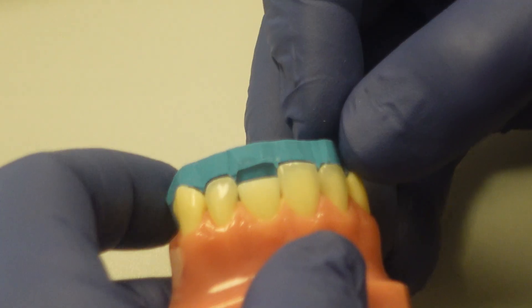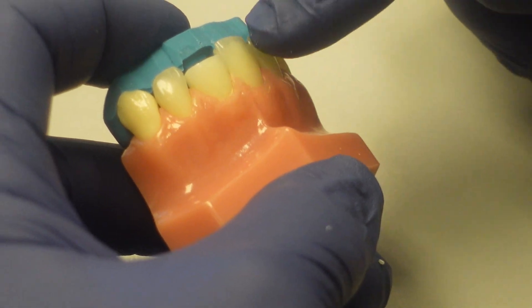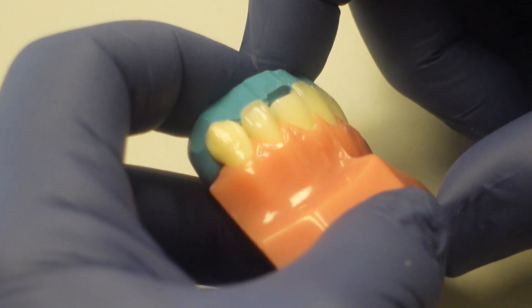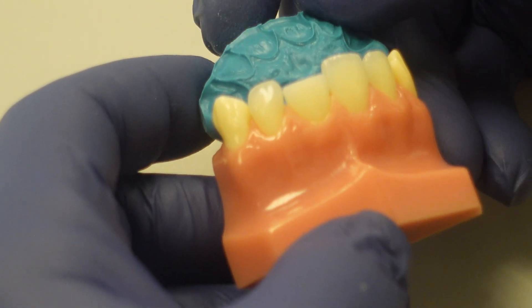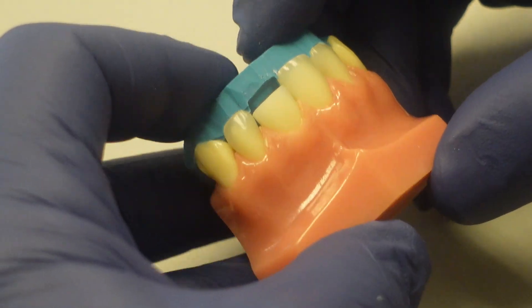Trimming this very exactly is really important, because if I've got a little excess and there's a little lip of material over onto the facial, then when I place my composite in there, I'm more likely to trap air bubbles. If I over-trim it and take a little too much away, then my incisal edge won't be the proper thickness. So you trim the template carefully.